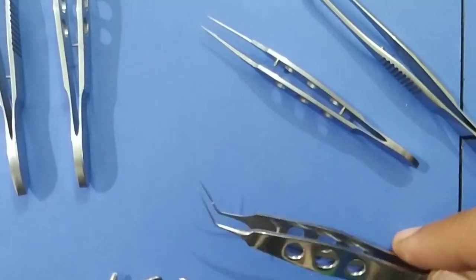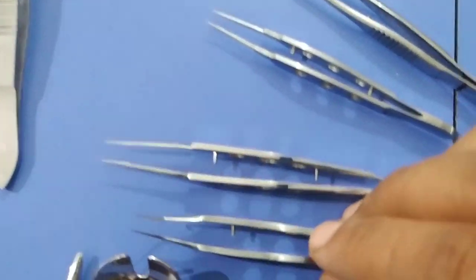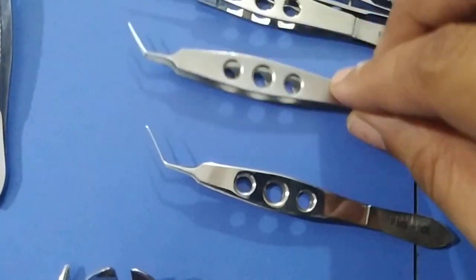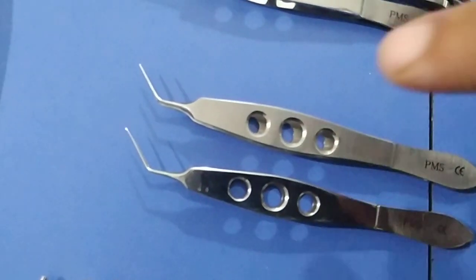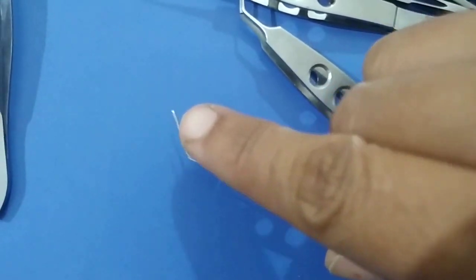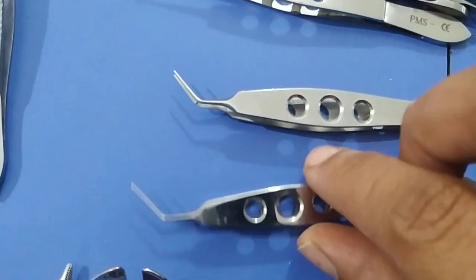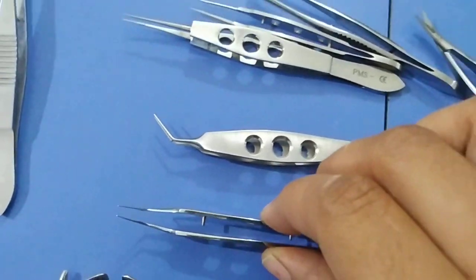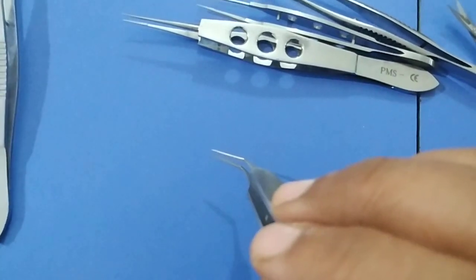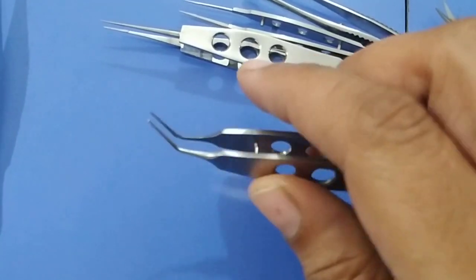This is a Macpherson forceps and this is a capsulorhexis forceps — these two are commonly confused. The Macpherson forceps has a curved end with nothing at the tip, while in the capsulorhexis forceps there is a small platform at the curved end. This is how you differentiate between them. Capsulorhexis forceps is used for performing anterior capsulorhexis during cataract surgery, while Macpherson forceps is used to hold and implant the PMMA or foldable intraocular lens into the anterior chamber, or to tie sutures along with tying forceps.